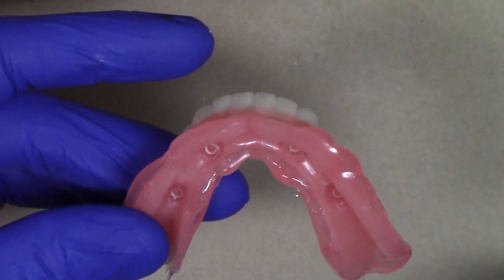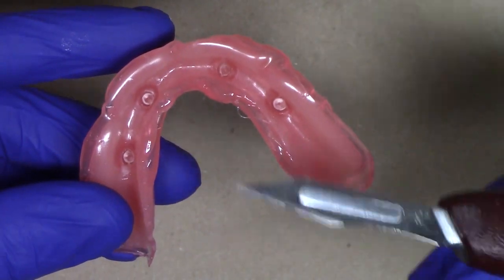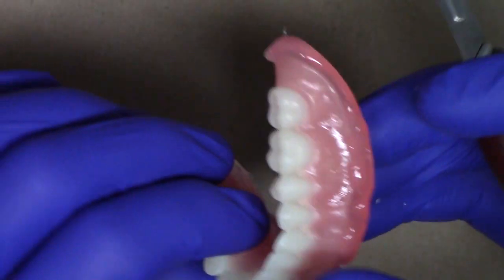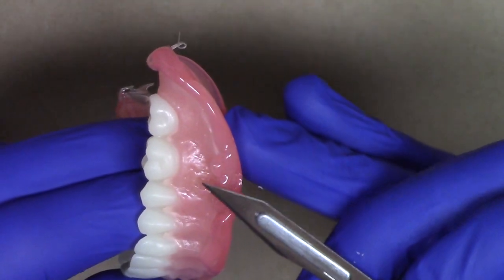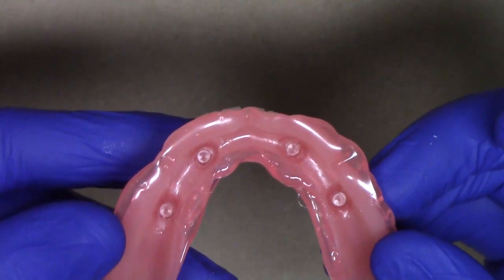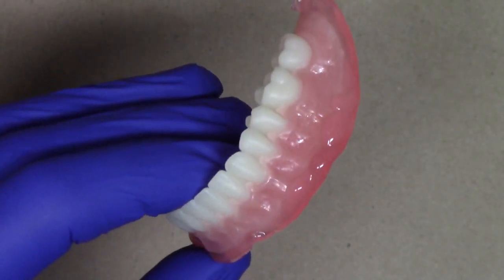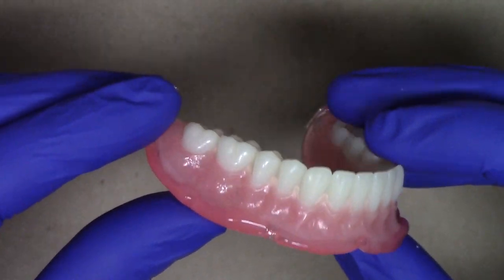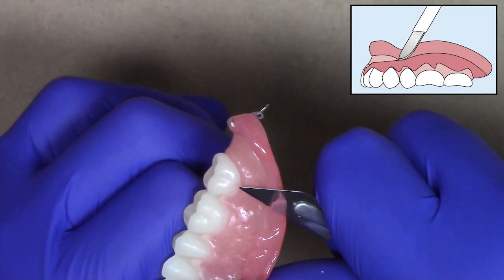There's a series of instruments that you do want to use here. First and foremost, we're going to be utilizing just a standard scalpel blade. This one is a laboratory style number 25 blade. What I like to do is go ahead and start just trimming the soft reline material around the borders. Keep in mind that this is on a benchtop demonstration in the laboratory. You would have better border molding control, and it would actually kind of thin out like this over the edge of the denture in an actual patient. But what I'm going to do here is just demonstrate as if I were doing this.